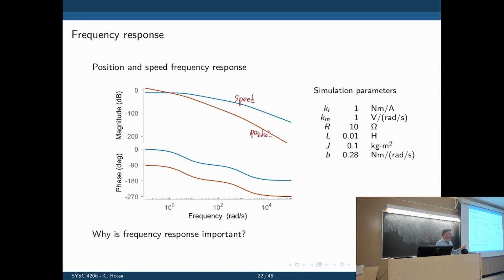But the choice of your DC motor now has strong implications on the performance of the haptic device. Because if you have a cutoff frequency that is way too low, you may not be able to change forces quickly enough in case the virtual environment wants you to.